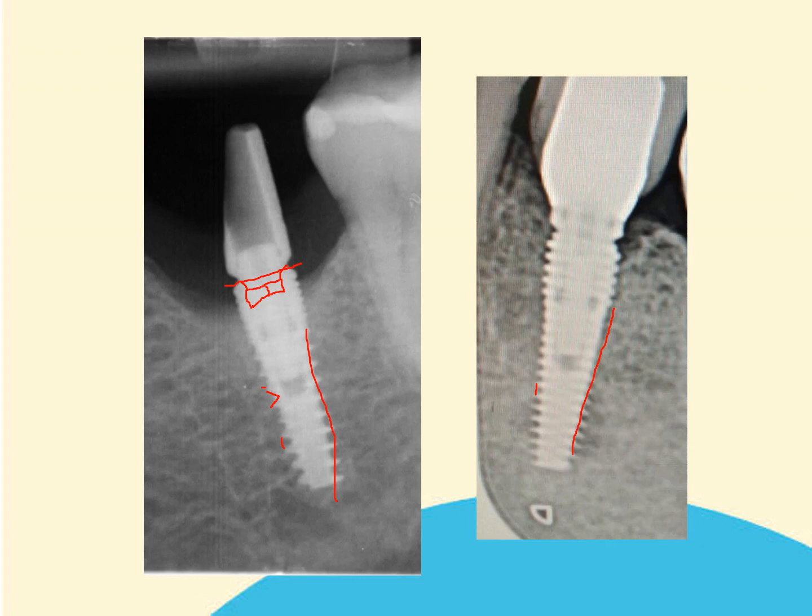Now let's look at the anchor lock type of connection. If you look carefully, you'll see that the base of the abutment is there and our implant platform is there. And there's a small vertical space between the two, which is a design feature to aid platform switching and our hermetic biological seal. Also, there is no 45 degree taper. You will not see a 45 degree taper and a hex on this system high up. What you will make out is perhaps a long lead in, and the hex is positioned far more deeply and runs out in that level there.